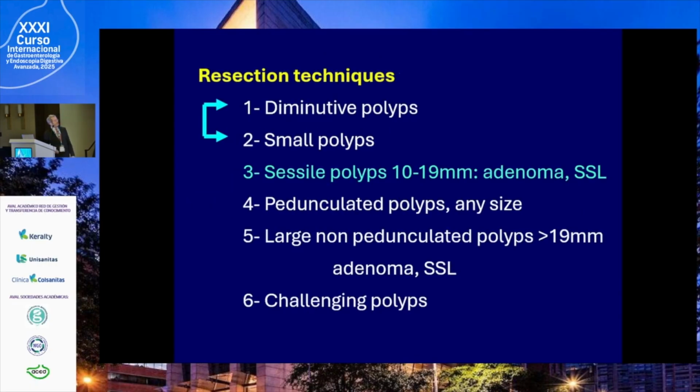Now, sessile polyp, 10 to 19 millimeters. In this case, you should distinguish adenoma from sessile serrated lesions. The procedures should not be the same, okay? Adenoma, Raoul? Resection, but yes, resection, but which tool?